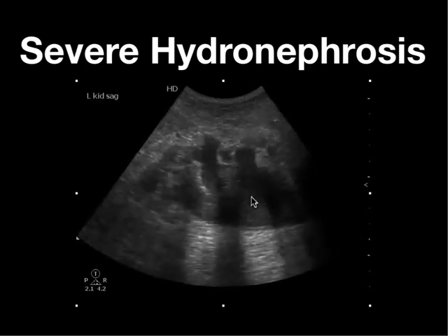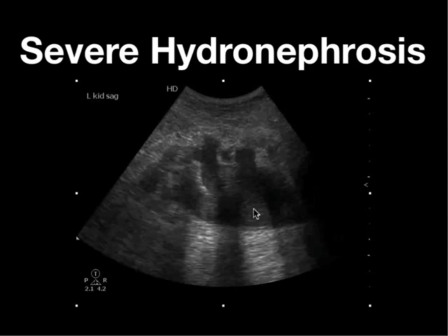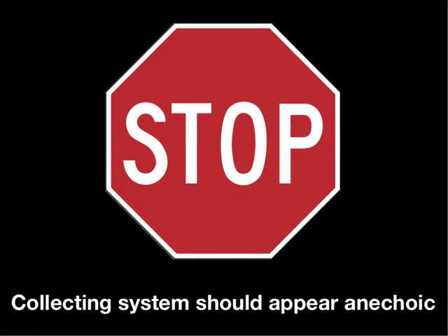There's something else that should stand out here: in uncomplicated hydronephrosis, the fluid within the collecting system should be anechoic. If the fluid appears echogenic, this is more consistent with pyonephrosis — or it could be blood. This patient had an obstruction for about eight to ten days and was febrile to 103 degrees. They were ultimately stented and found to have pyonephrosis. Key point: the collecting system should appear anechoic; if it's echogenic, that's either blood or purulent debris.